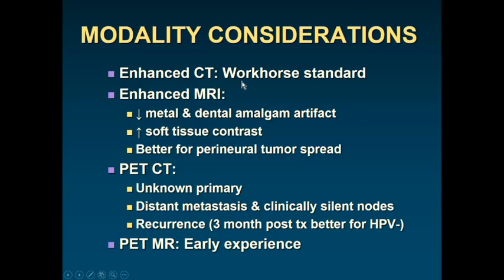In terms of modality considerations, I think most places use contrast-enhanced CT. This is the workhorse standard. It's fast and easy, with fewer issues with secretions and so forth. Patients can tolerate it really well.